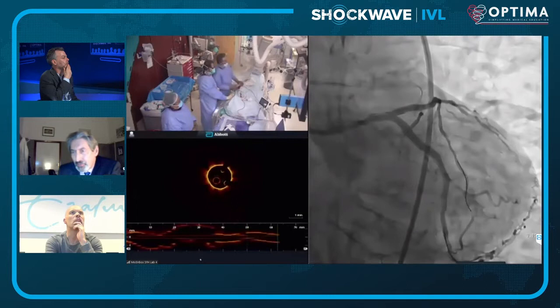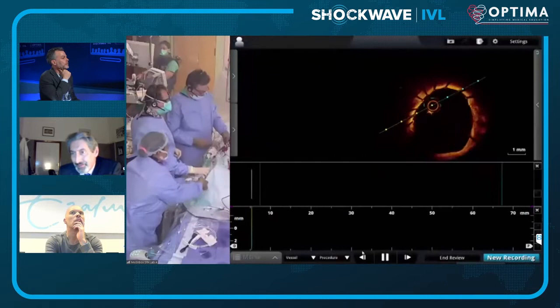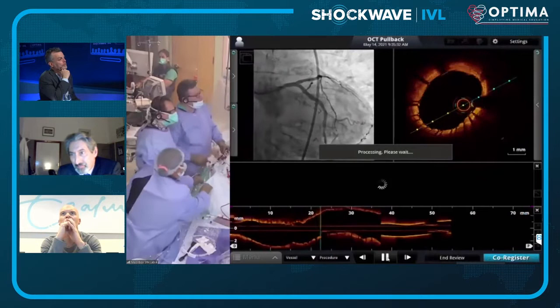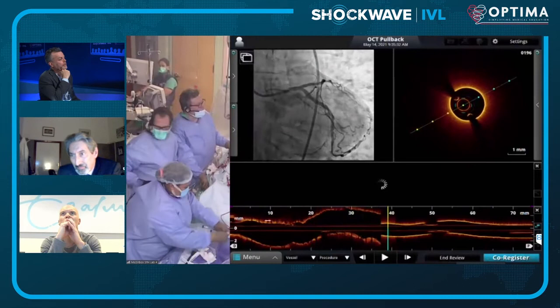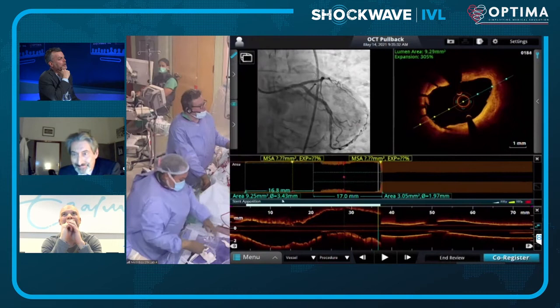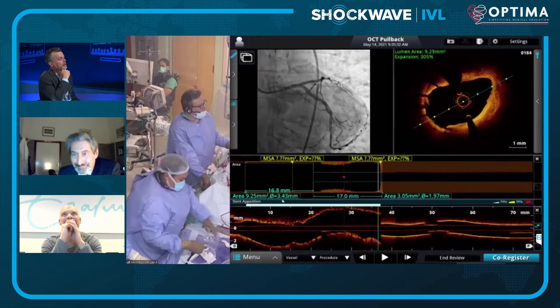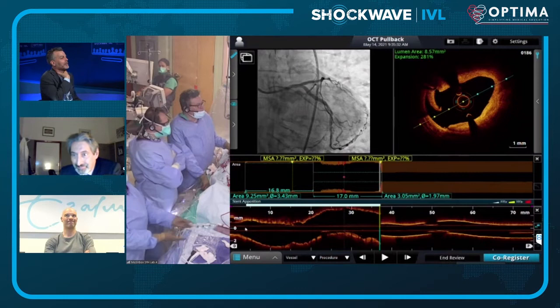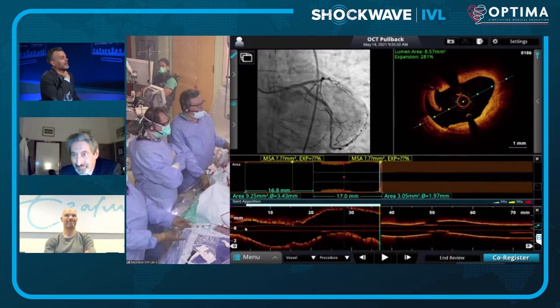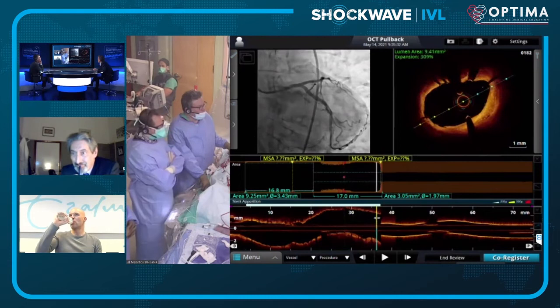A further OCT run is performed. You can see a beautiful lumen, and then examining the proximal edge and ostium, a dissection is visible — it goes to the media. There are nodding heads from the panel: they're a bit more lenient with a proximal dissection when a stent is in front of it since propagation is less likely, but if it goes to the media it needs to be covered.